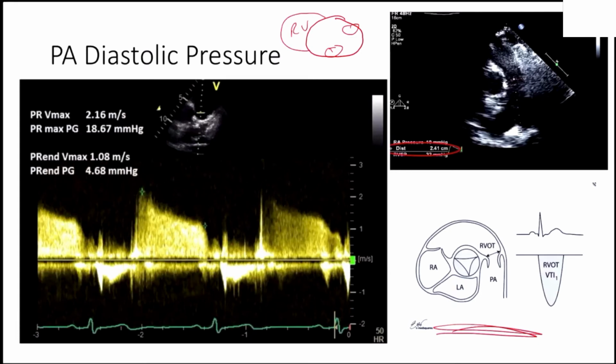If you now take your probe and you start to flatten it out onto the body, so you're trying to look more anteriorly, right? What are we going to see? We're going to start to see our mitral valve, right? And then if you keep fanning up forward, you see your Mercedes-Benz sign of your aortic valve. If you're able to rotate your probe a little bit to the patient's ipsilateral shoulder, so their left shoulder, you start to pull out the right ventricular outflow tract, okay? And here we see our pulmonic valve, right, and our main pulmonary artery.